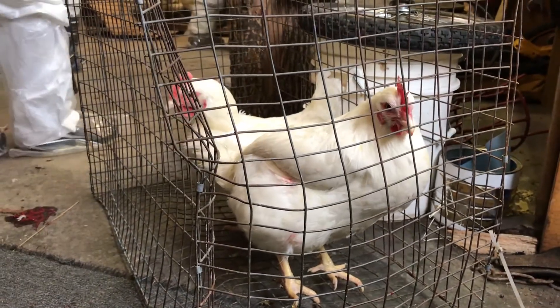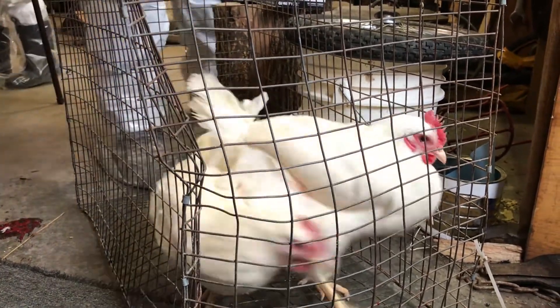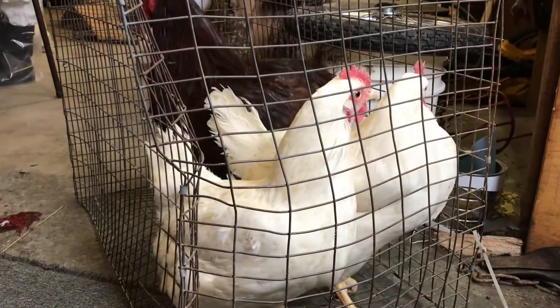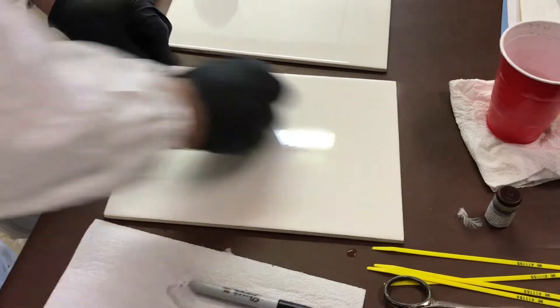Before the next birds are tested, wipe the plate clean with water. Use a dry towel or clean paper towel to thoroughly dry the plate before using again. Any moisture left on the plate may interfere with the agglutination test and make the test mixture run.